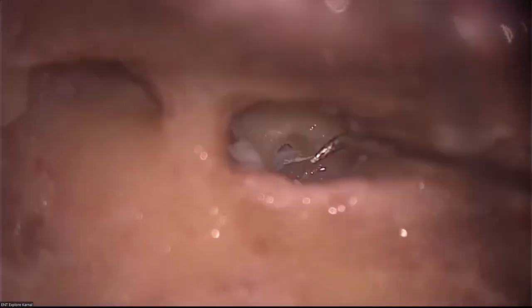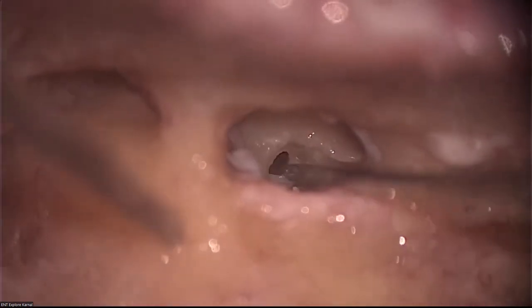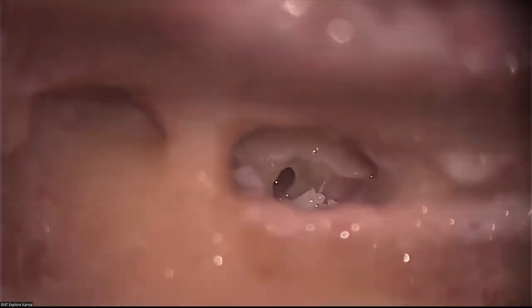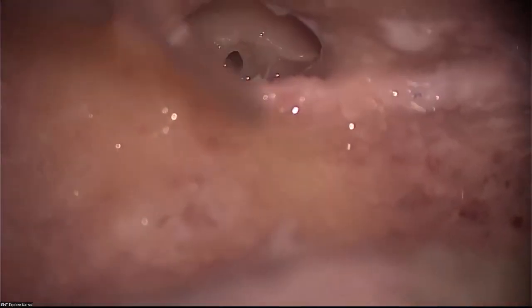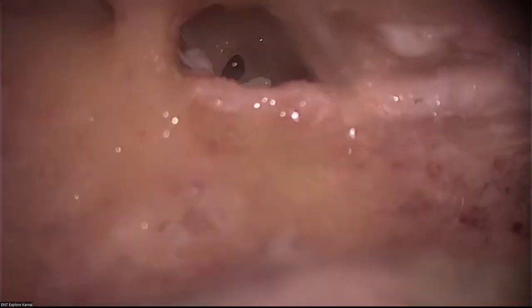See this round window. Yes, the round window membrane. Just to open up, we can see the scala tympani cavity. And this is a favorable round window, I would say. It's a favorable round window in the sense that it is not posteriorly rotated.